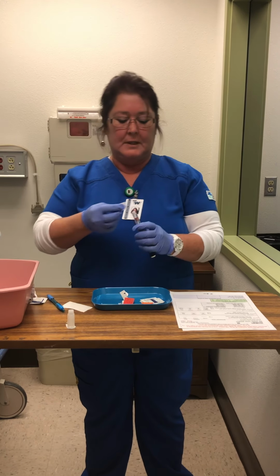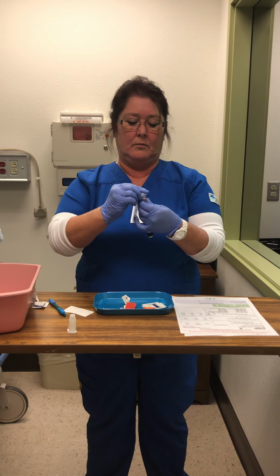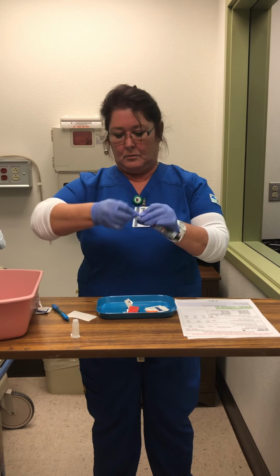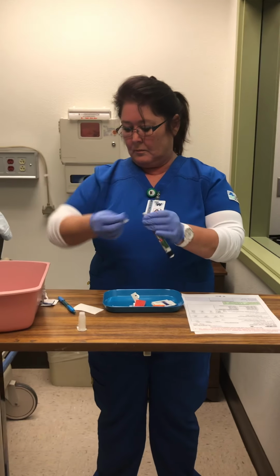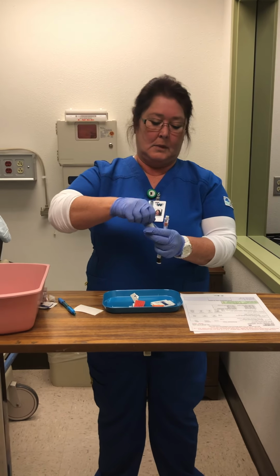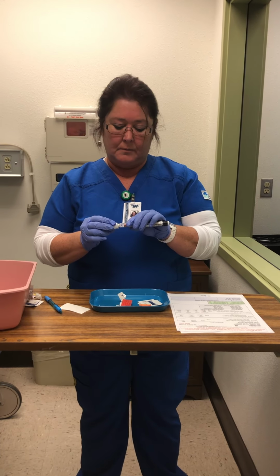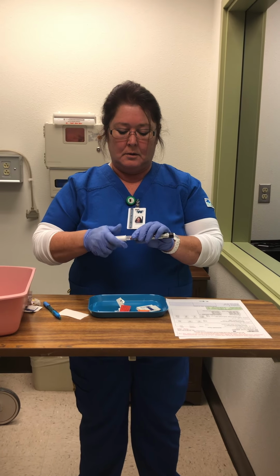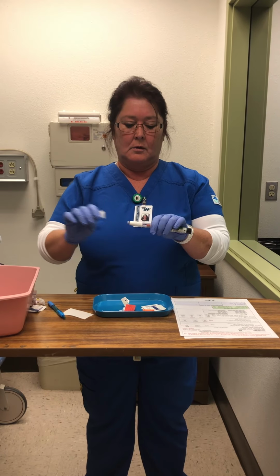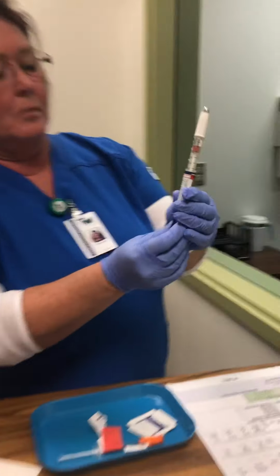And I'm going to clean this for 15 seconds. And then I am going to get my needle, which is sealed. I'm going to open this up, and I'm going to screw this on, making sure that it's tight, but not so tight that it breaks. And then I'm going to prime the pen. So I'm going to dial the 2.